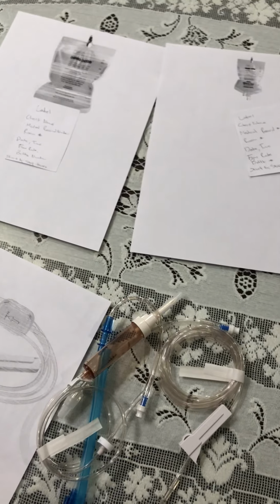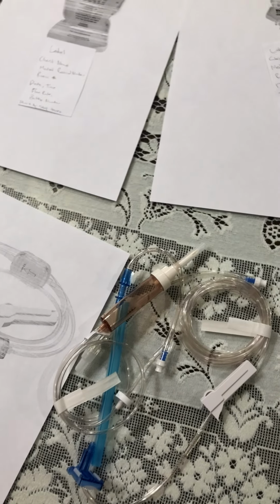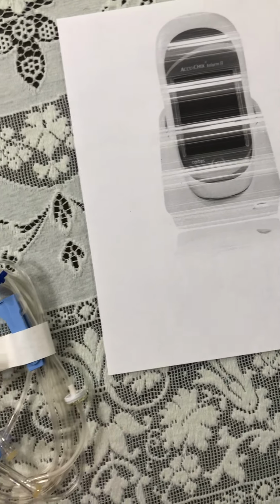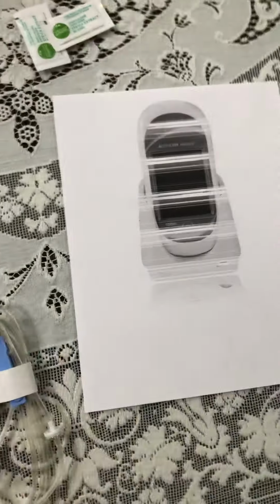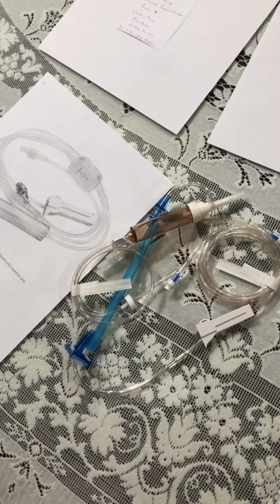After that is complete, I want to put my patient's bed down, put the rails up, do hand hygiene once again, and assess the labs I mentioned in the beginning, assess the vitals periodically, and assess for the potential complications I verbalized. Assess the blood glucose readings, depending on physician's order, or generally every 4 hours. And after that, I want to document what I performed, and I believe that is it. Skill is complete. Thank you.